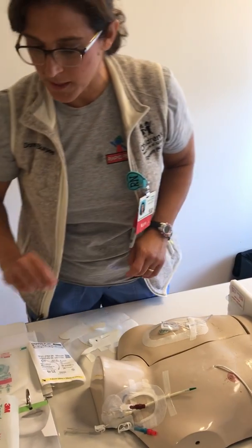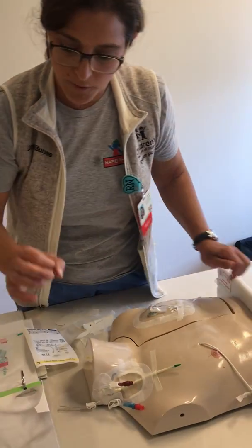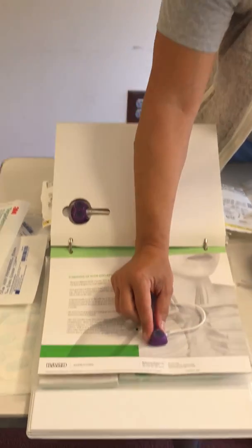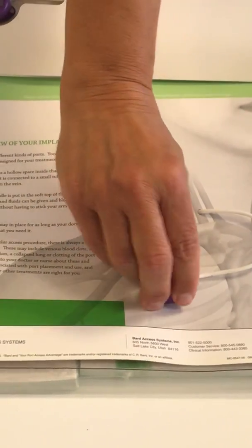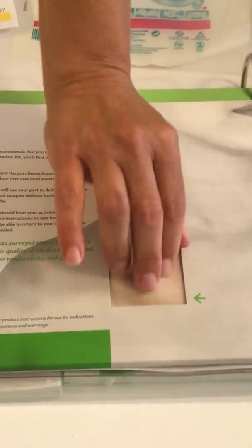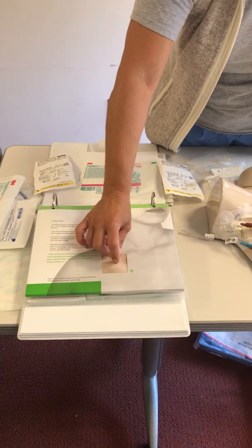Oh, power ports. So there's two different kinds of ports. You've got a standard port, which is round, and you've got a power port, which is triangular and has these three little knobby things. You can feel it. Usually the power ports are kind of small, and you can usually feel it. If you can't feel it, the x-ray can always tell you if it's a power port. It'll show the triangle shape.